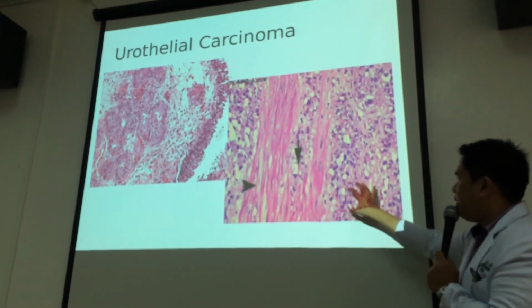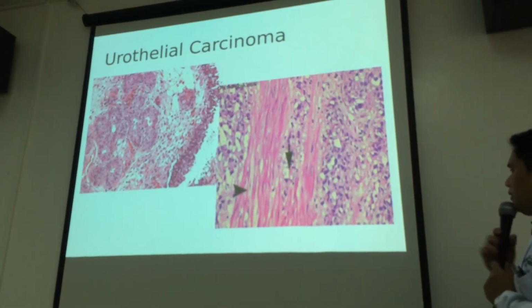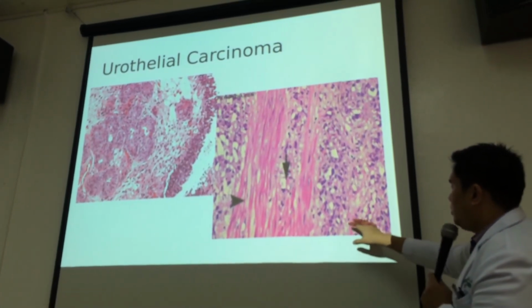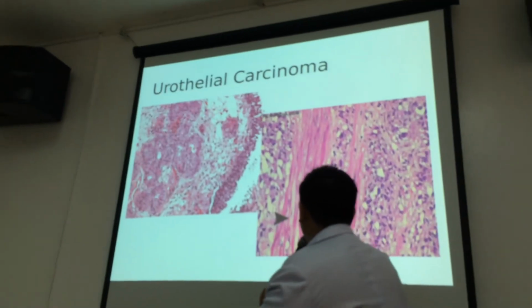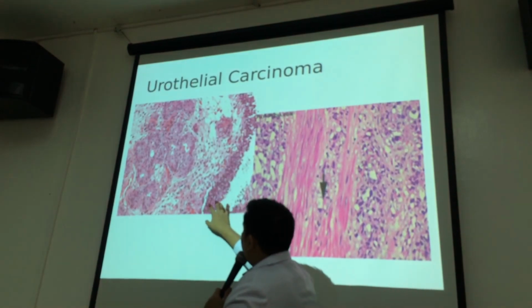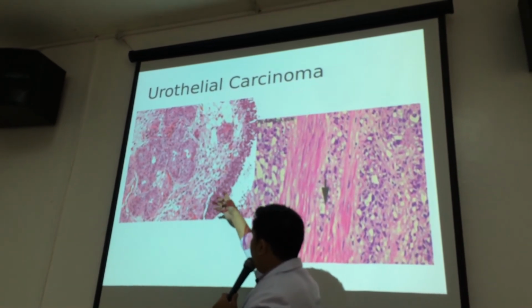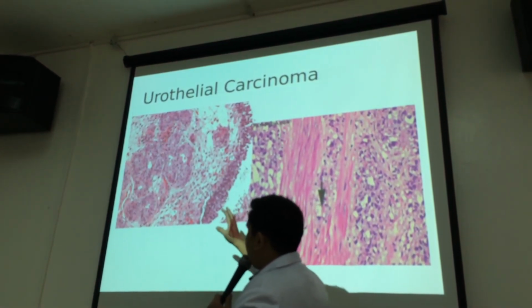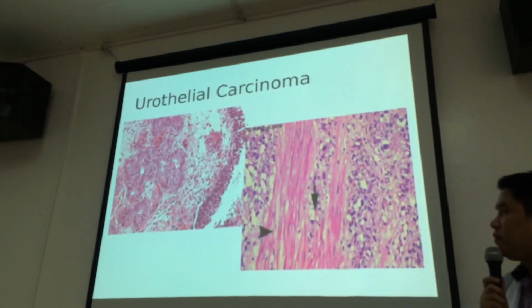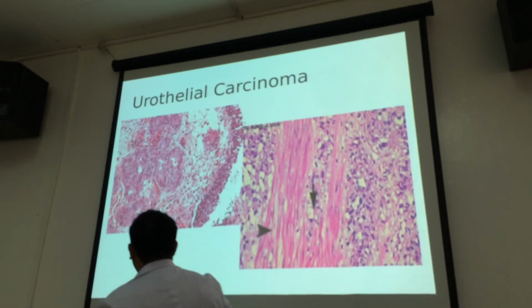In this case, the malignant tumor cells are haphazardly distributed. You can no longer understand each arrangement. There are no basement membranes. They are not forming what's this? Tubular structures or others, glandular formation. As in this case, this is also a malignant lining of uroepithelial tumor cells. You can no longer identify the basement membrane. It's no longer intact. Underneath, within the submucosa, is the invasive component of the tumor. So the invasive component of the tumor is forming these tubular structures.